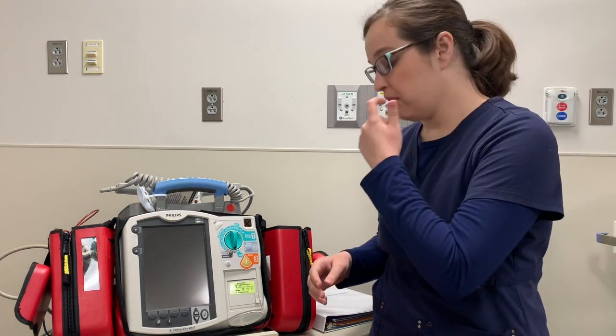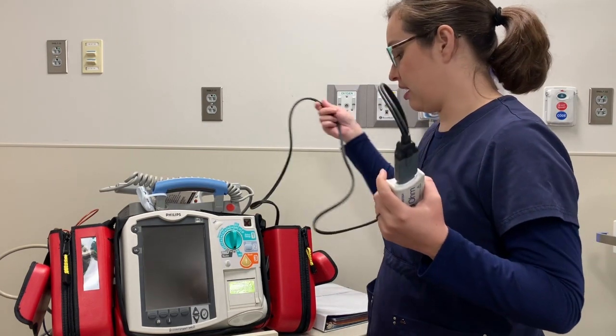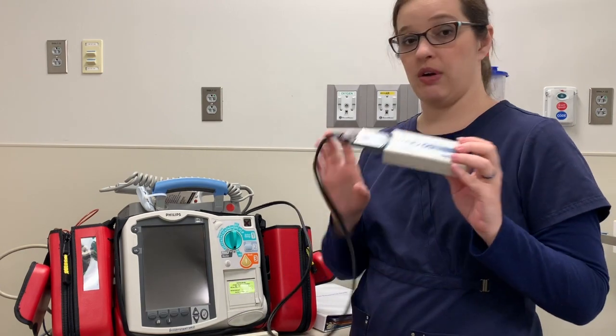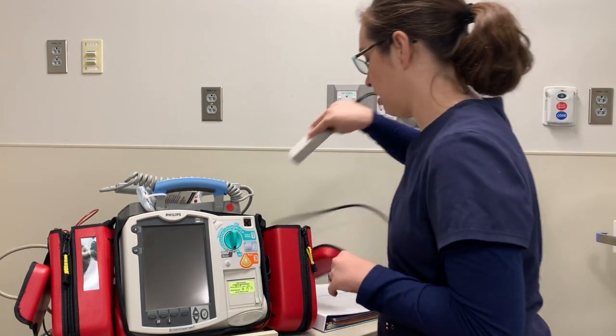Moving on to the monitor — the way that we keep it set up here is that we always keep the attachment for the pads attached to the monitor because that's what's used most frequently in the hospital setting. You've got this test load that's attached to it. This allows us to check the defibrillator and not shock anybody, so it dumps the electricity there.